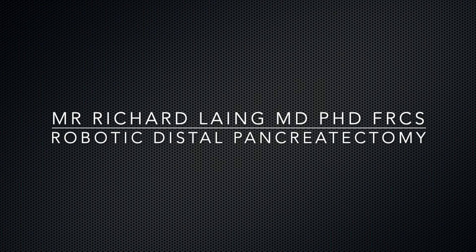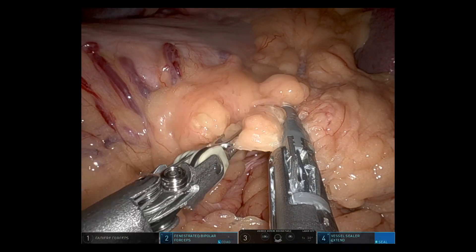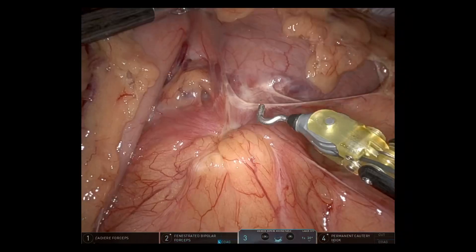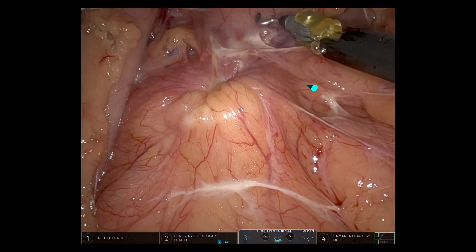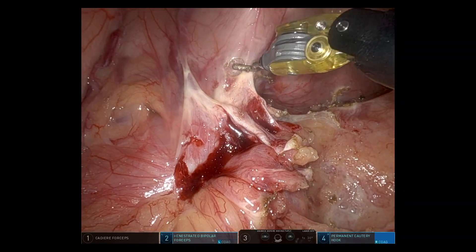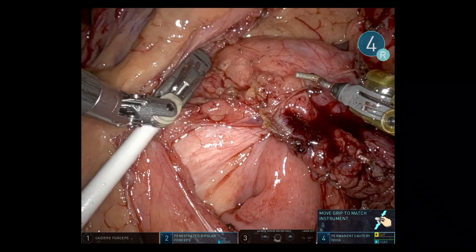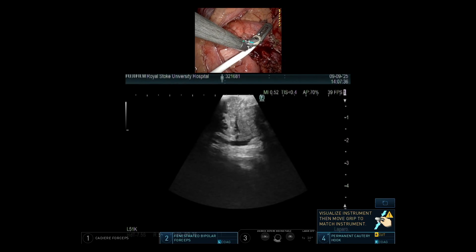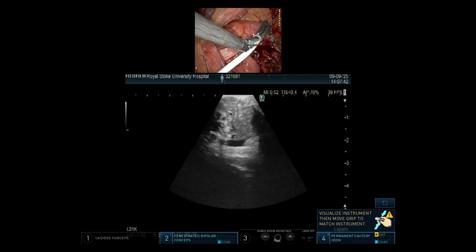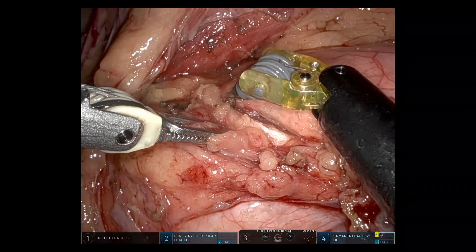This is a robotic distal pancreatectomy on a 69-year-old patient with a pancreatic body tumour. You can see the tumour there puckering the tissues around it and drawing in the posterior wall of the stomach. Dissecting this off and scanning the tumour to look at the relationship with the vessels — there was definite splenic vein involvement posteriorly.